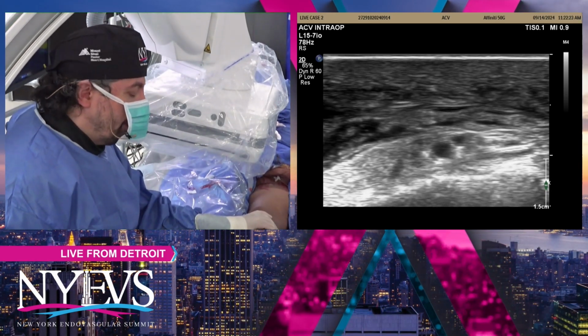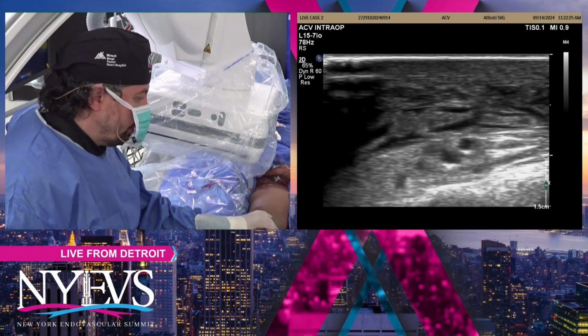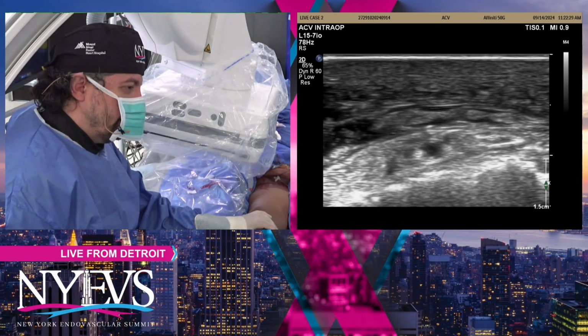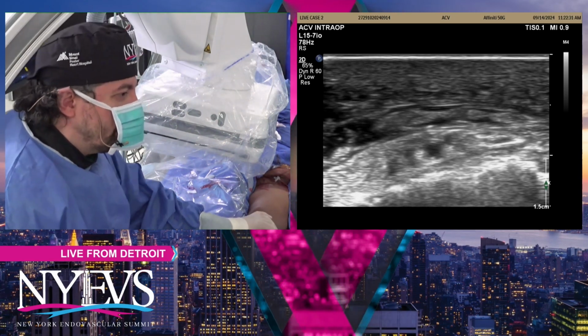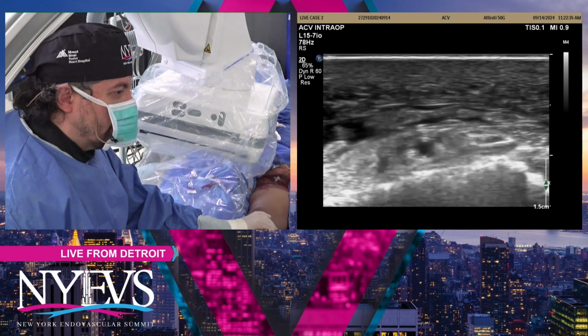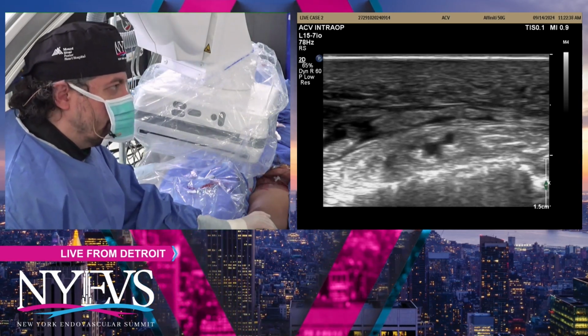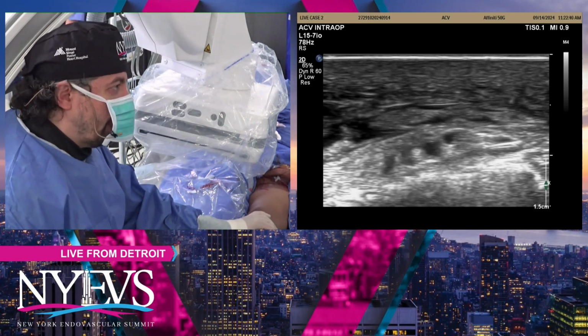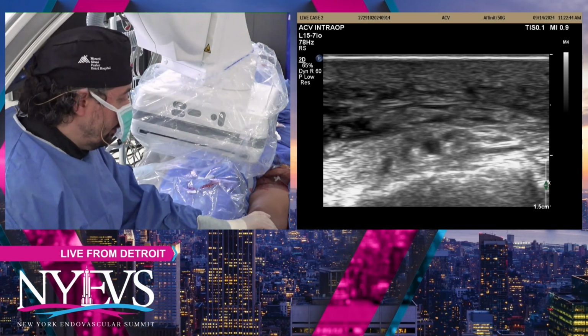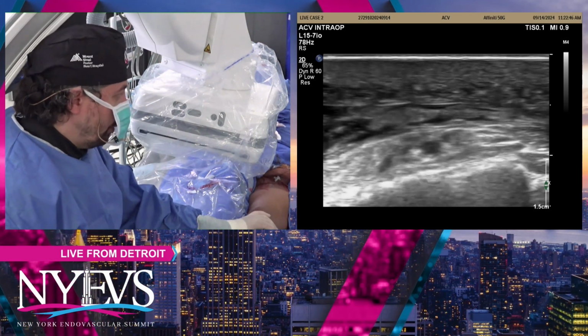Now, the question becomes, well, if you don't have an interventional ultrasonographer with you, how can you utilize those services? Sometimes we've had people that will train their techs to perform these procedures, especially for scanning for complications such as perforations and hematomas. You know, that's a valid approach.